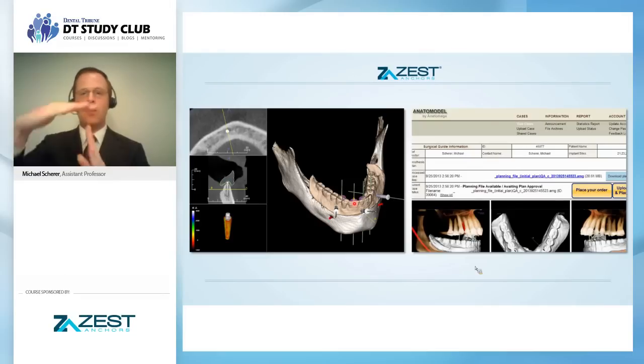Because if we can get the locator attachment to be perpendicular to the occlusal plane, every time that patient functions, it's not going to be incorporating as much potential maintenance and wear as if the implants were tilted like this in relation to the occlusal plane, or in and out motions when the patient removes and inserts the prosthesis. And that's so critical. Because how many times in your clinical practice have you seen, whoa, this patient's going through attachments like candy? Take a look at this. This is a significant factor that can be related to improving your long-term clinical success.